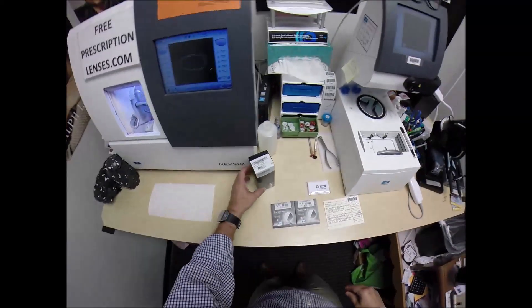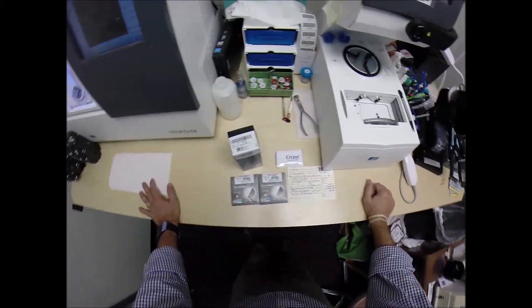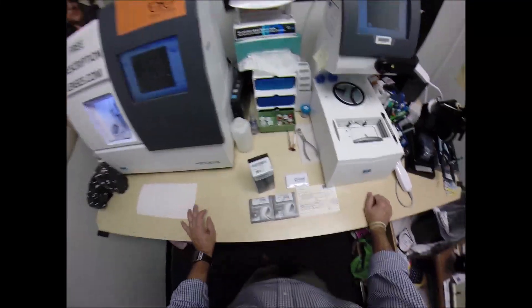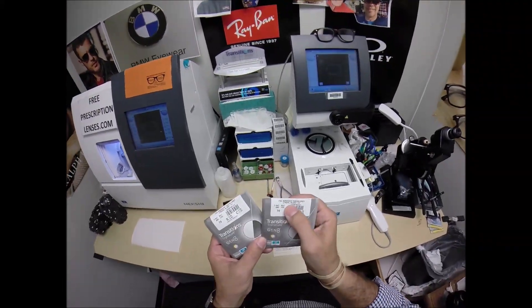But call me Moe, Moe Better. Because I'm going to have you seeing Moe better, looking Moe better. I'm going to show everyone else how I bring that loving feeling back to glasses, when I cut the new Transitions Generation 8 Gray Lenses with Crozol Alize.